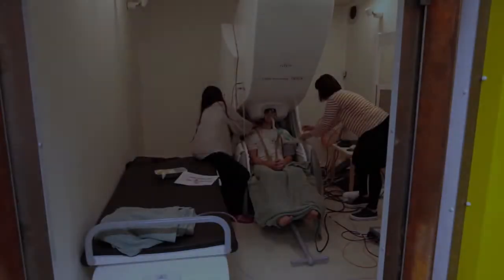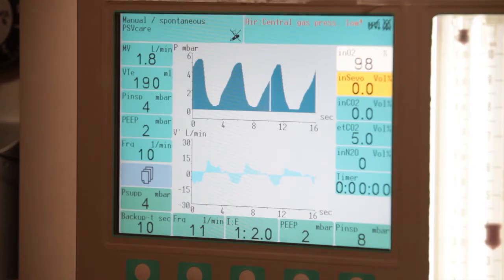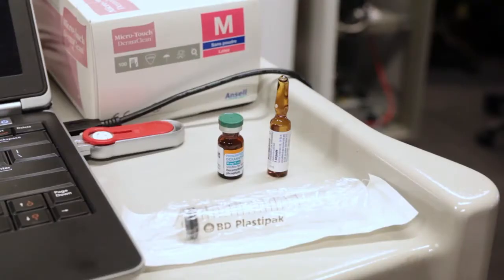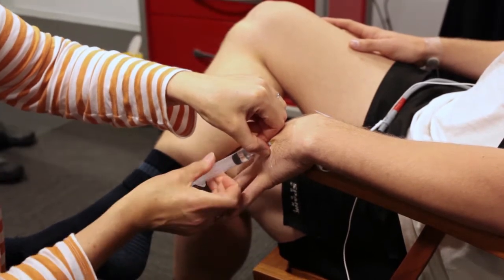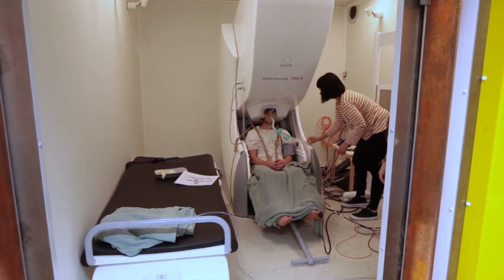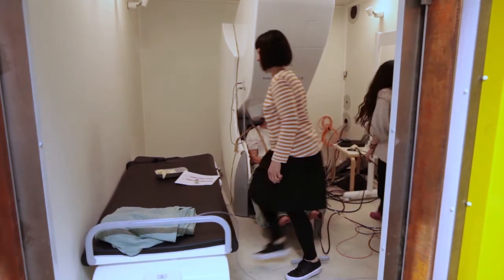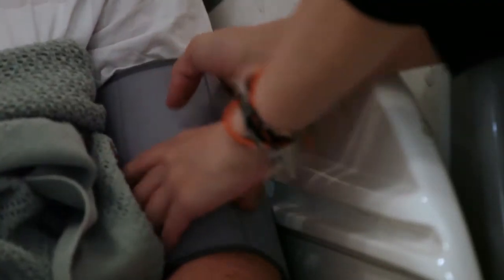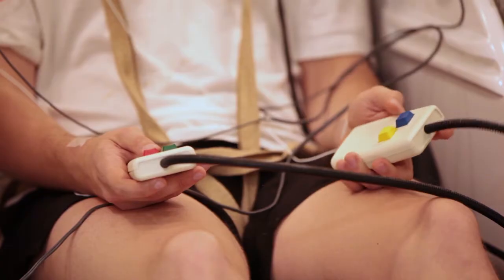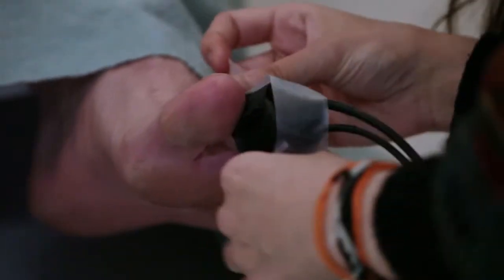At this stage, the participant will be comfortably seated in the MSR having been denitrogenated, and having been administered dexamethasone and ondansetron to minimize the risk of any adverse nausea or vomiting due to gas administration. Before the MSR door is closed, the anesthetic nurse or other suitably trained medical professional is seated next to the participant. A final check is made that the blood pressure cuff is connected, the button response boxes are comfortably positioned, and the pulse oximeter on the toe or finger is securely fastened.